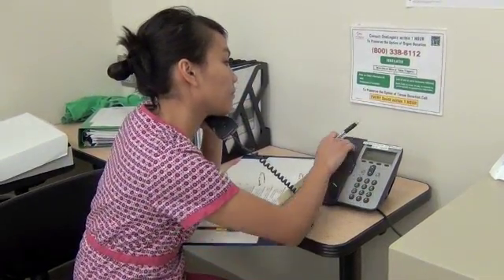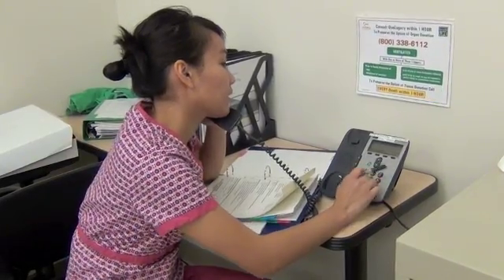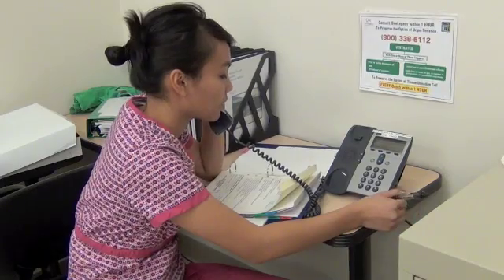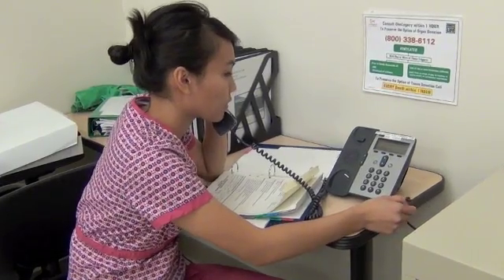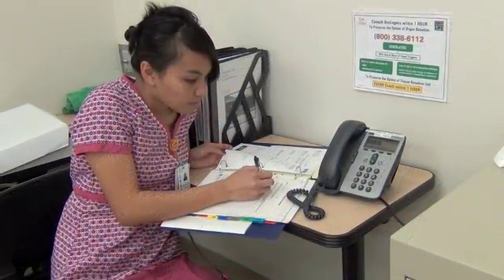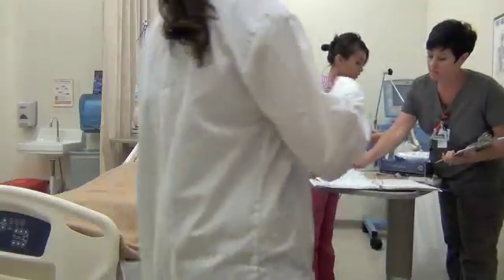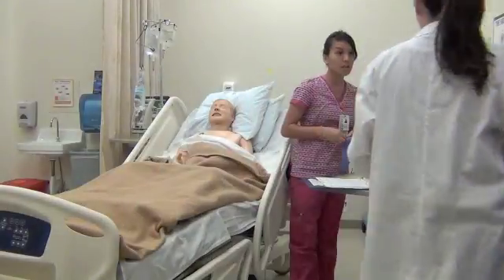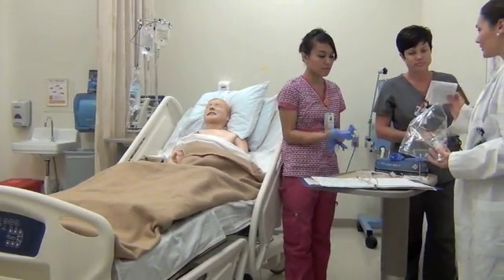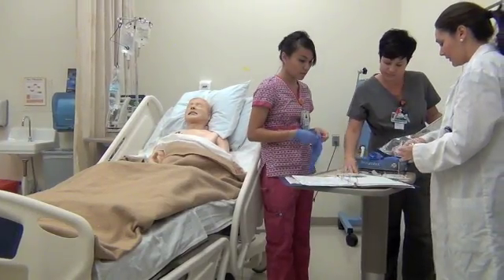Following policy, the nurse follows the first step of contacting the physician. The physician will then place an order for Cathflo Activase to be administered to the line. The pharmacist then delivers Cathflo Activase to the nurse with step-by-step instructions.